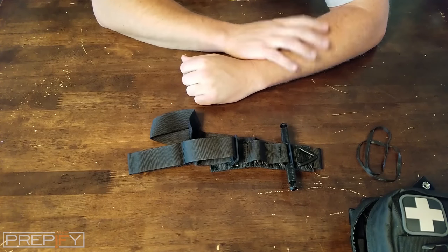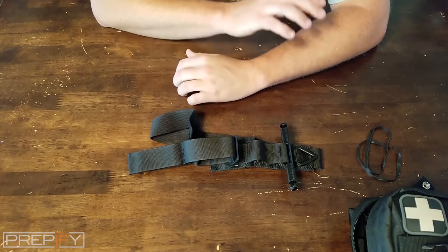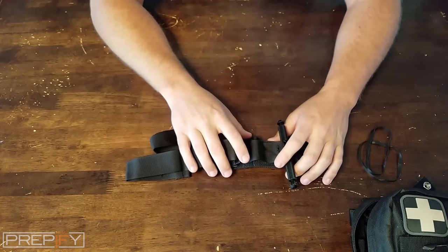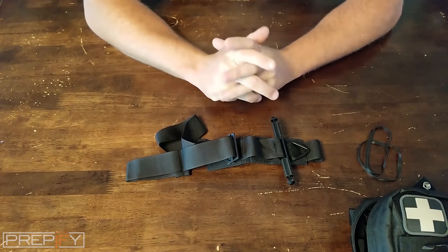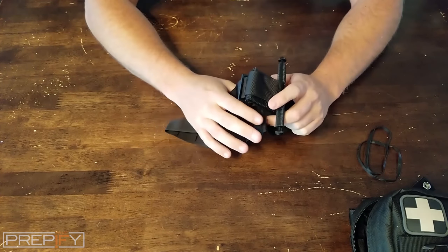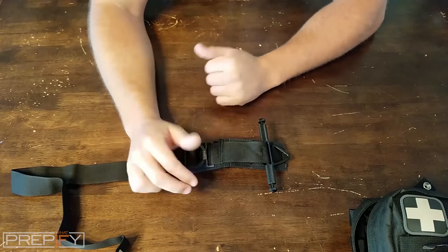If you have one tourniquet, you have none; if you have two, you have one — so it's better to carry two. If you fall and break an arm or leg, you can also use a tourniquet for splinting: take a stick or board, place it alongside the limb, and use the tourniquet tightened down on each side to help hold that splint in place. It's a great piece of equipment with multiple uses.